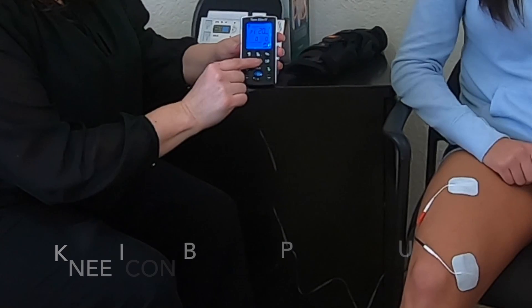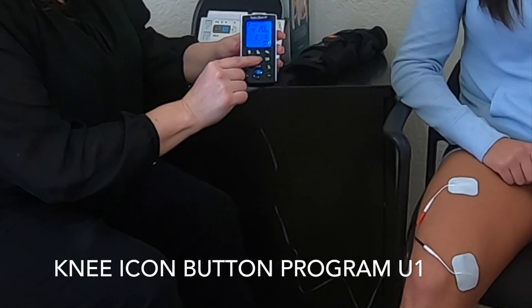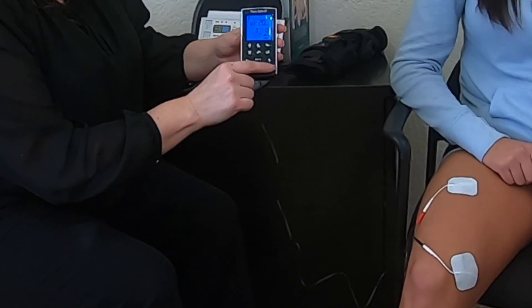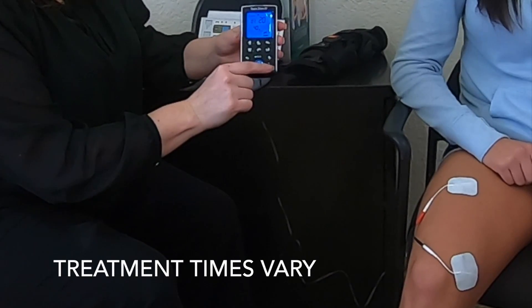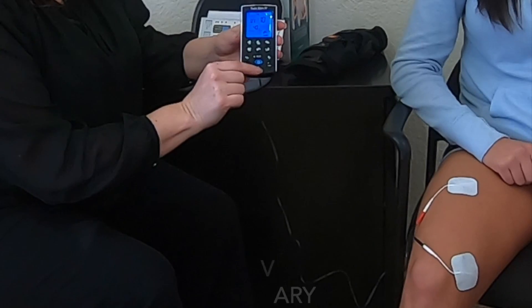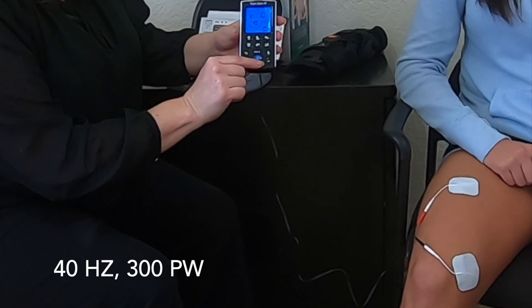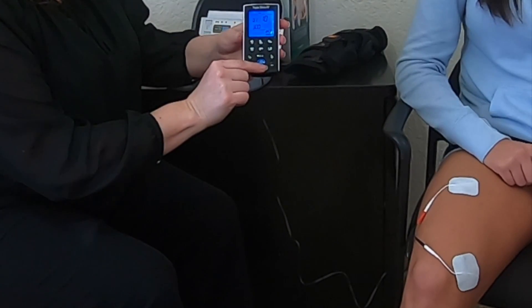Go to the knee setting, select U1, and customize it. We're going to do a 10-minute treatment time — press S for settings, go down to 10 minutes. Press S again and leave it at 40 Hertz. Press S again — that's the pulse width, which is 300, and we'll leave that the same as well.